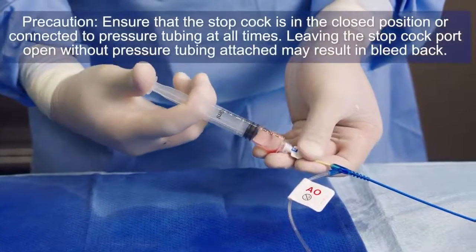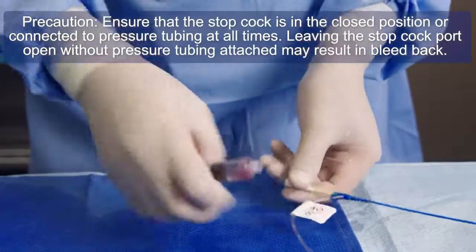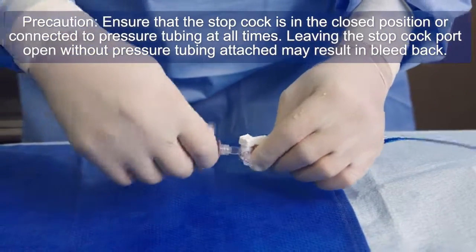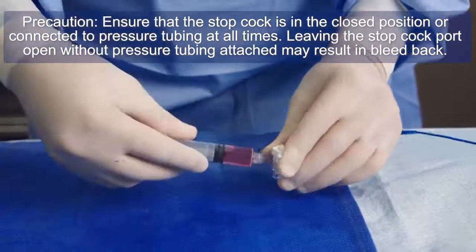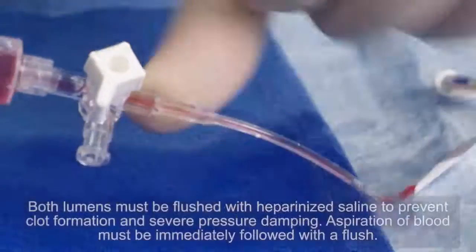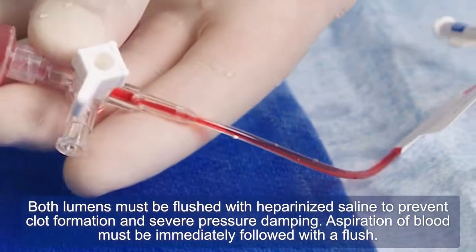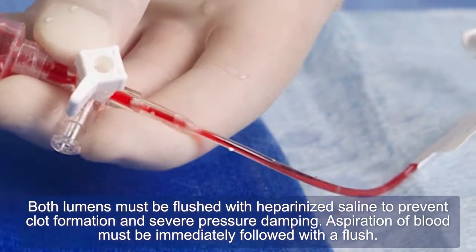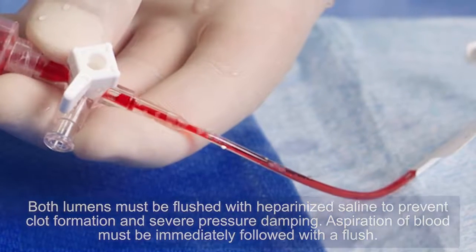Precaution: ensure that the stopcock is in the closed position or connected to pressure tubing at all times. Leaving the stopcock port open without pressure tubing attached may result in bleedback. Both lumens must be flushed with heparinized saline to prevent clot formation and severe pressure damping. Aspiration of blood must be immediately followed with a flush.